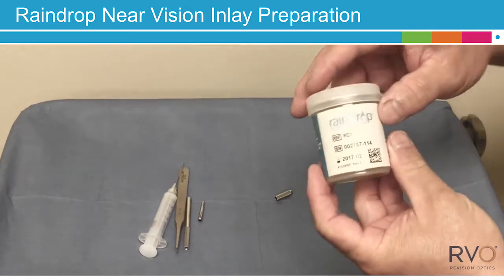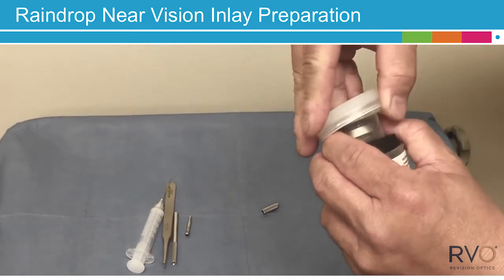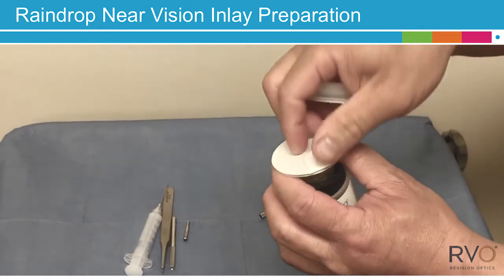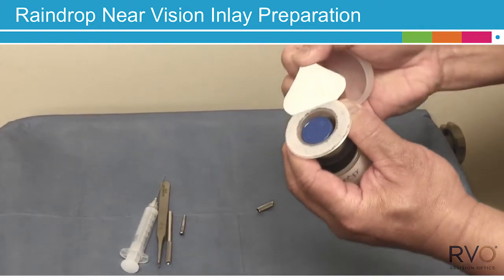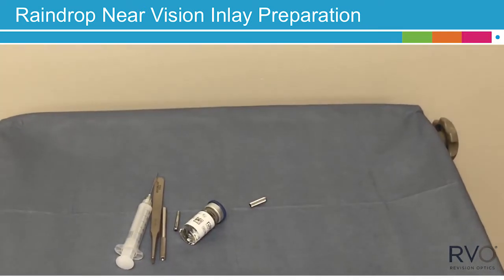Next, open the plastic container that holds the Raindrop inlay. Remove the serial number label for later use. Remove the plastic cap, then carefully pull back the Tyvek lid and transfer the glass vial to the sterile field.